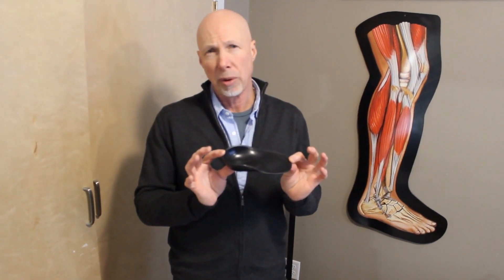By ordering the hip square for the other side — so if you're a right side, you would order for the left — then you can square up your hips and make things more comfortable for you.